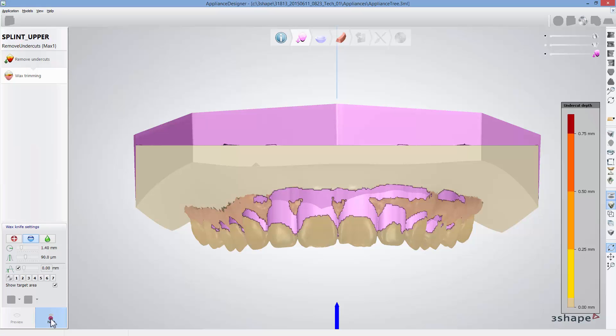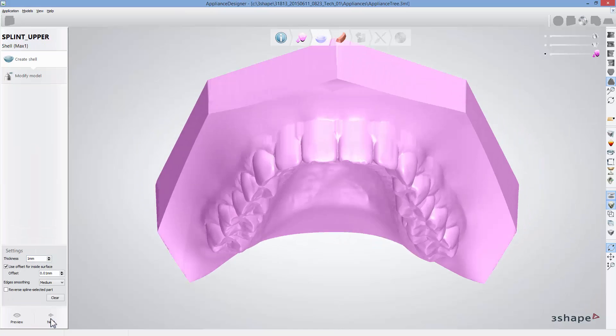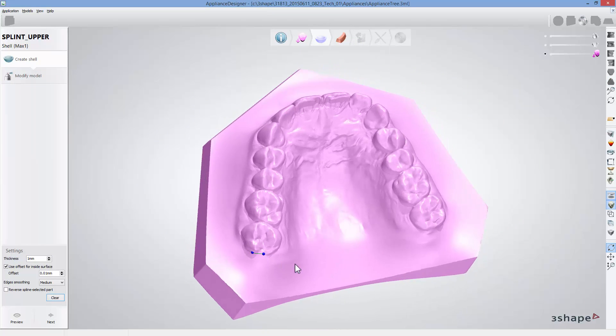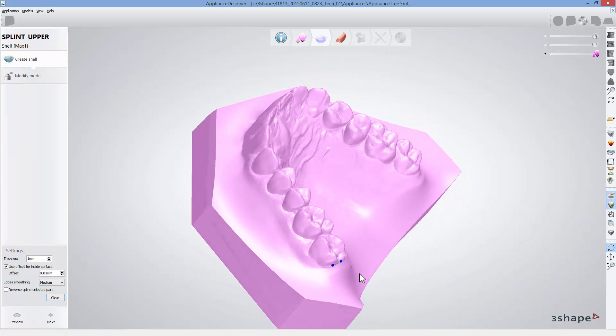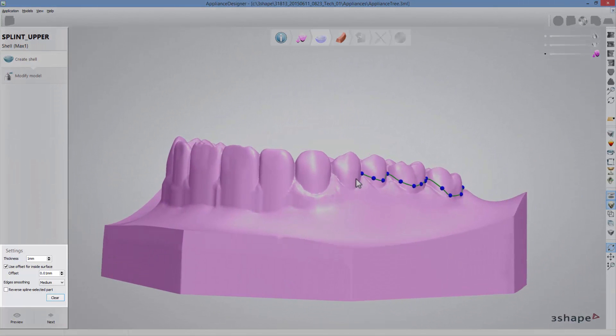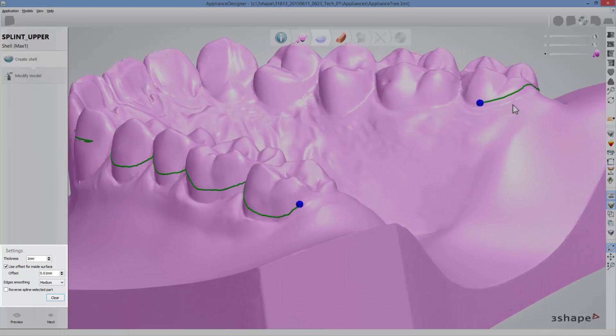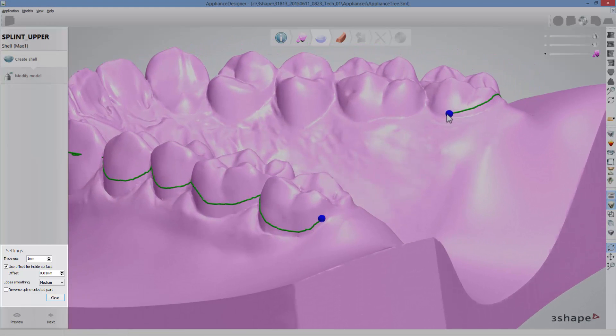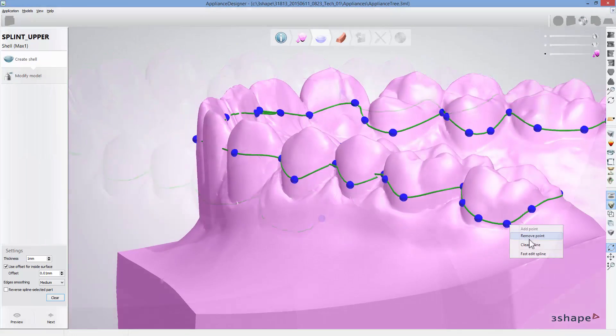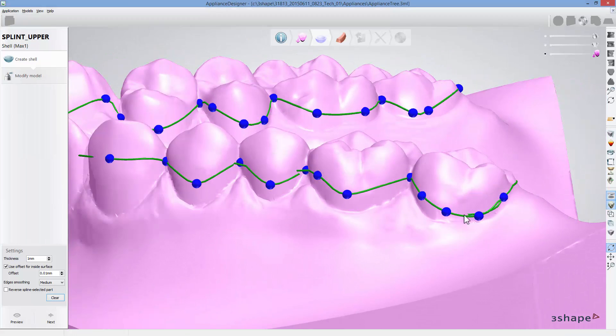Click next again to get to the splint shell design step. Now you can start designing your splint. For that, in the settings menu set required splint thickness, offset and edges configuration and then set the margins of the splint.